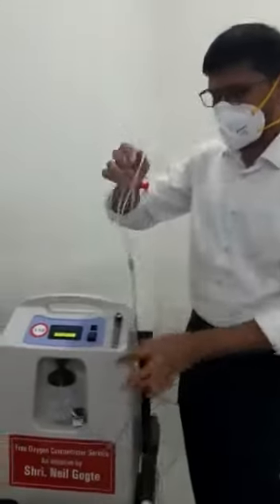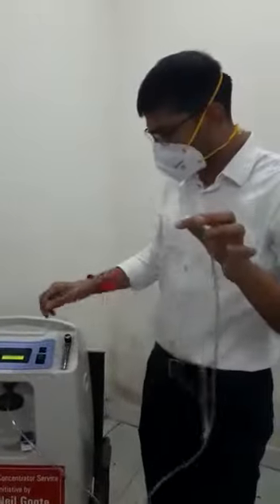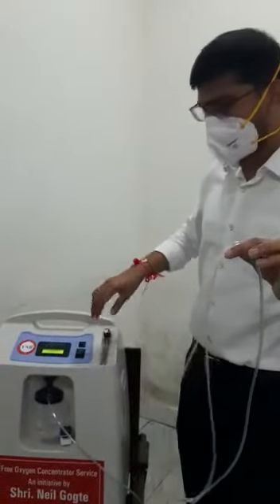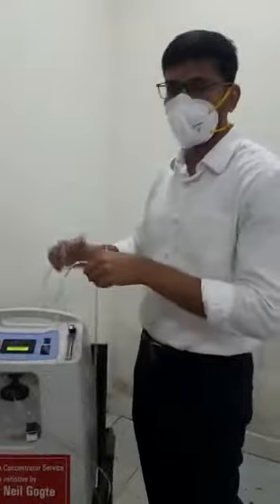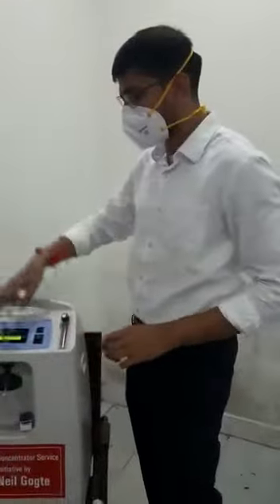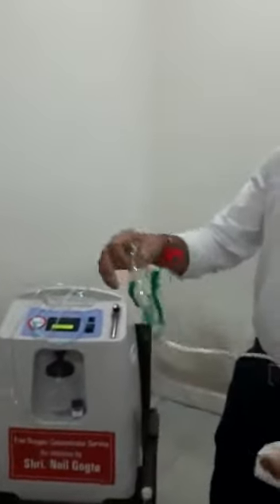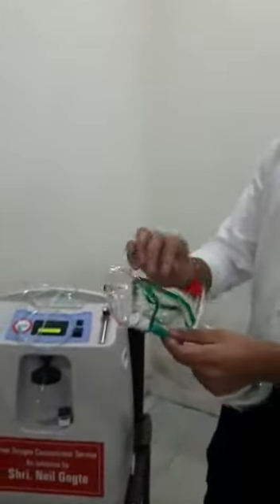The nasal cannula works only up to 4 liters. If the patient needs up to 4 liters, you can use this. But if the patient needs 5 liters, that means he is not maintaining on this and you probably need to refer him to hospital. However, if you want to give 5 liters before doing that, you can use this mask — this mask can deliver 5 liters.